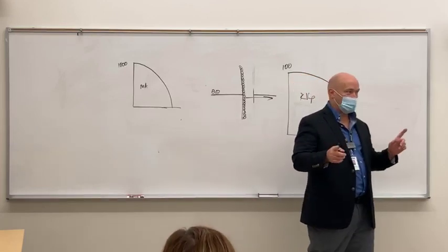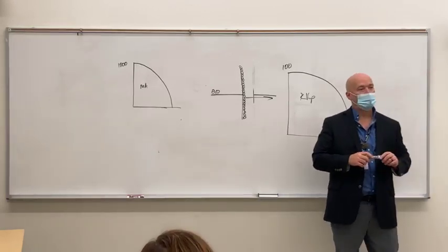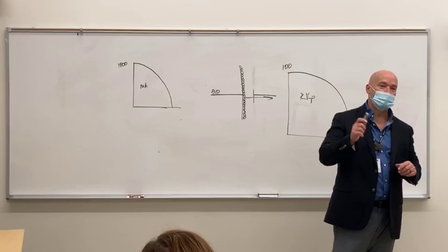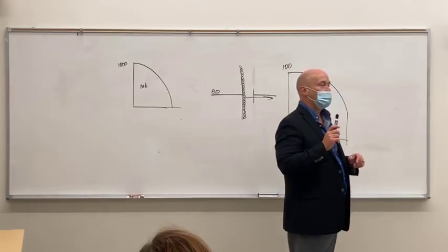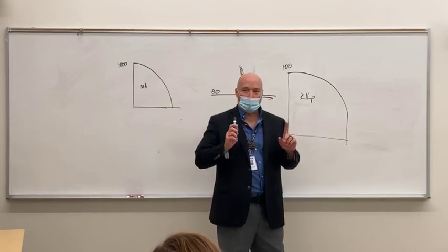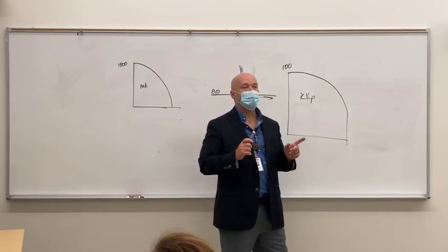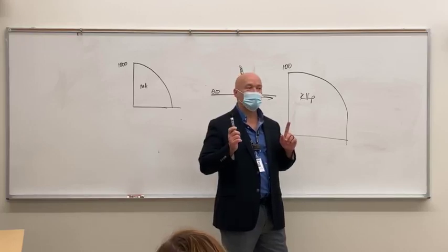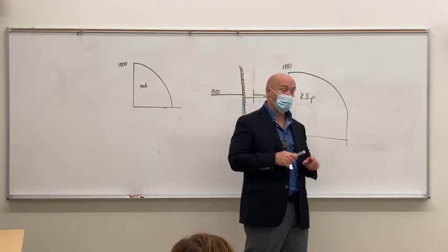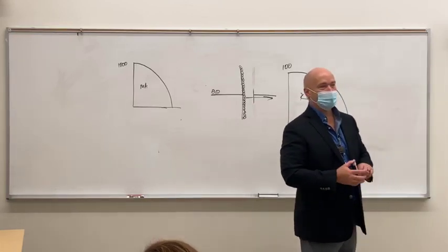So is it in the low voltage circuit? There are questions on the test, very specific. Is it in the low voltage circuit? No, it's in the high voltage circuit. Does it work off of low voltage though? Yes, okay? What's the general rule for true false questions? The whole thing has to be right or the whole thing is wrong. Okay, you've been warned.